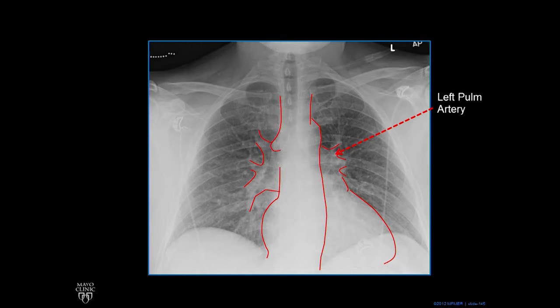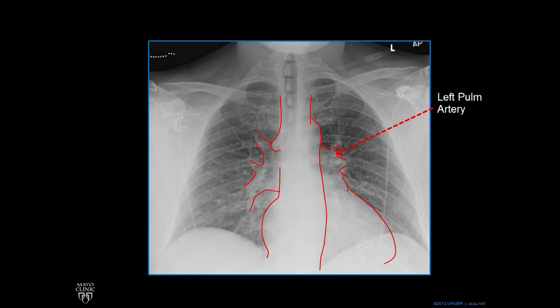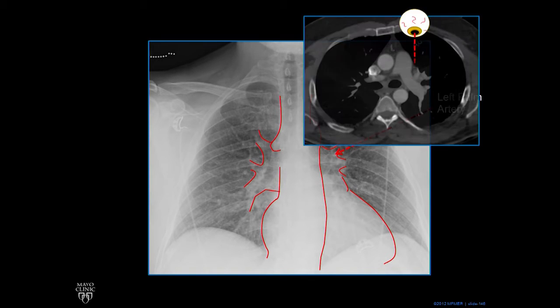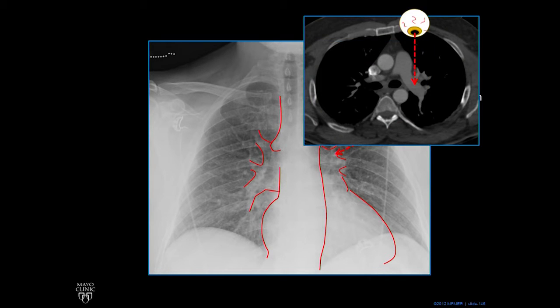This contour — that's the left pulmonary artery. We've already seen that the right pulmonary artery runs left to right in front of the trachea. The left pulmonary artery is going to run front to back, and you can sort of see it — there's the left main bronchus, it's the airway. The left pulmonary artery goes over front to back and makes an arch, almost paralleling the aortic arch, which you can see better here — it sort of runs front to back like an arch.